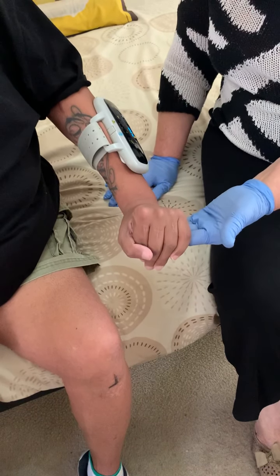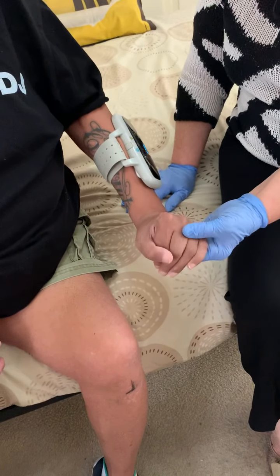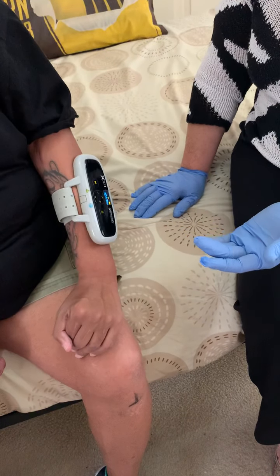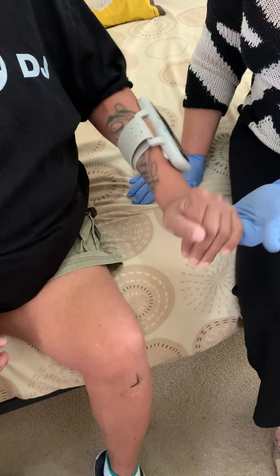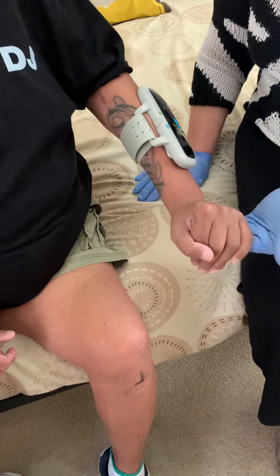How do you do? My hand is still — you realise that. Can you feel a bit of grip? You're the one that's moving. Can you feel a little bit of grip? A little bit. Yeah. Put it back down. It's nice and relaxed again. From your back to open my hand, gripping my hand there just to shake and I'm putting it back down.